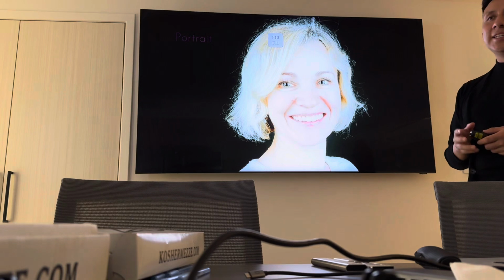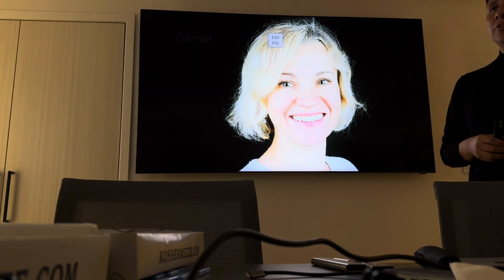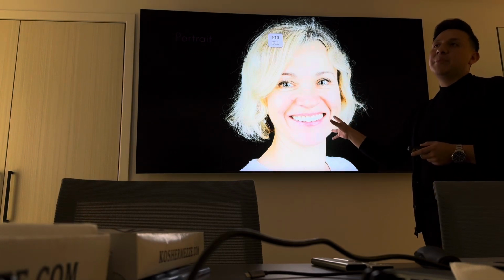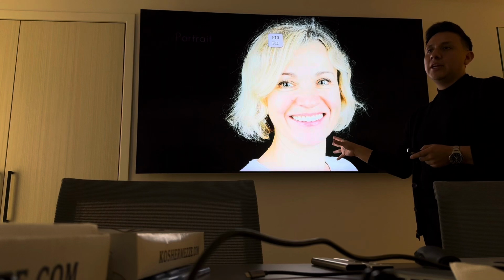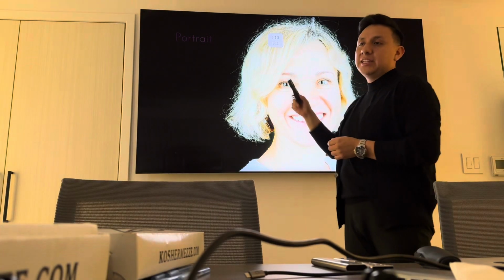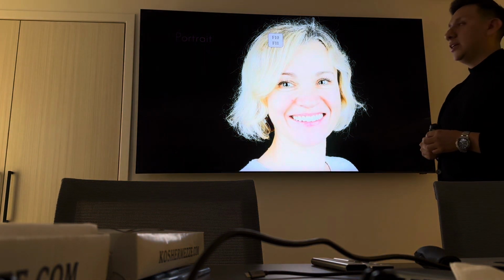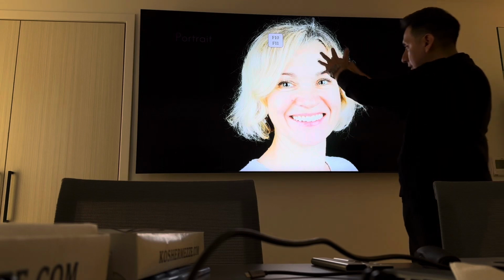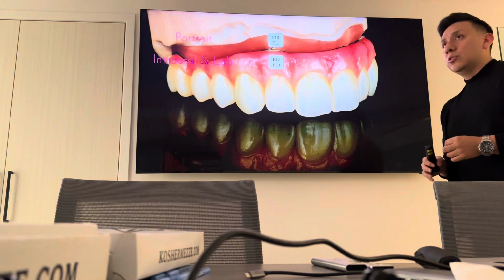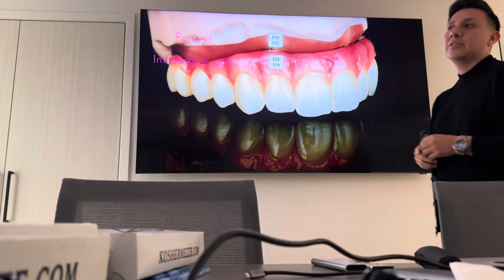So what are the settings that I use? Okay, so first of all, the camera has the f-stop or the aperture, okay? When we're going to take pictures like this, portraits, we're always going to choose between f10 and f11. Why is that? Because we don't need so much depth, and we like to capture the whole frame of the picture. If you want to do portraits or sometimes these kinds of pictures from the lab, okay?